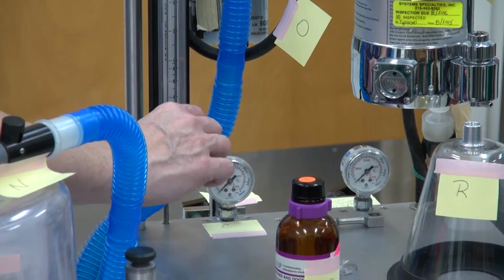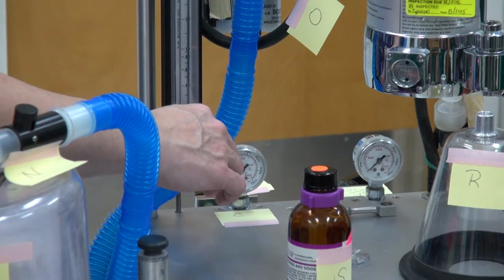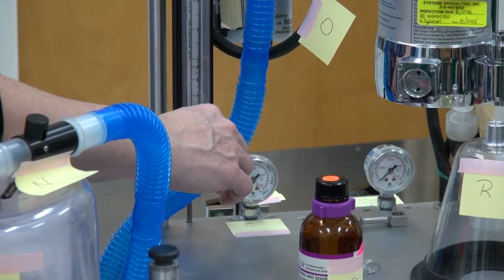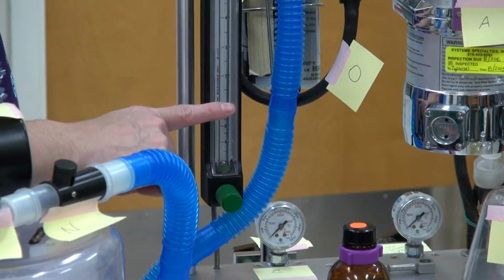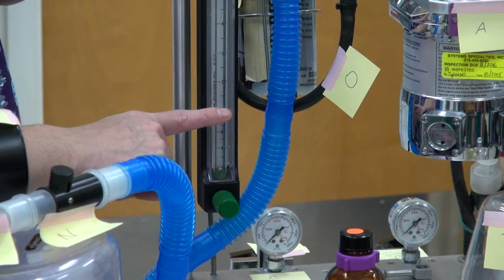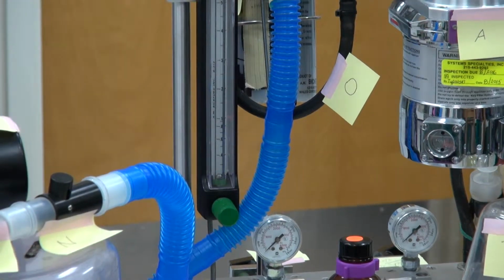Do we want to be careful with our knob to turn it? Yes, because what can happen? You can strip it. Then our ball is going to move around and jumble around. It's not going to settle on where we need to be. Okay? C.